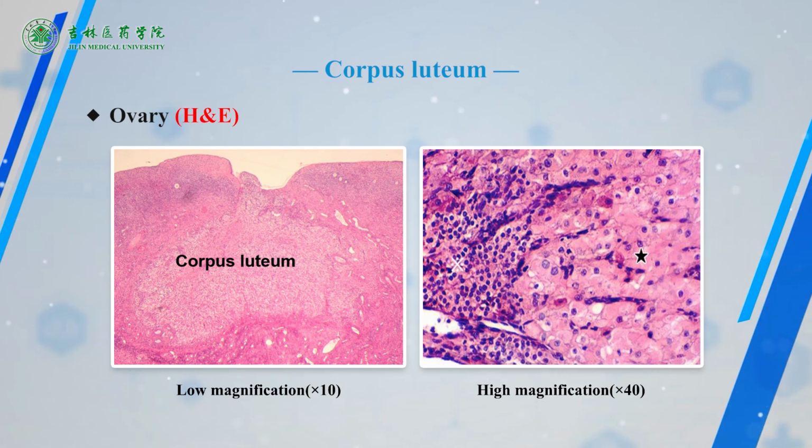At the periphery, there are clustered small cells with little red-stained cytoplasm. Nuclei are small too. These cells are theca lutein cells, which sometimes exist between the granulosa lutein cells. The granulosa and theca lutein cells constitute the corpus luteum.